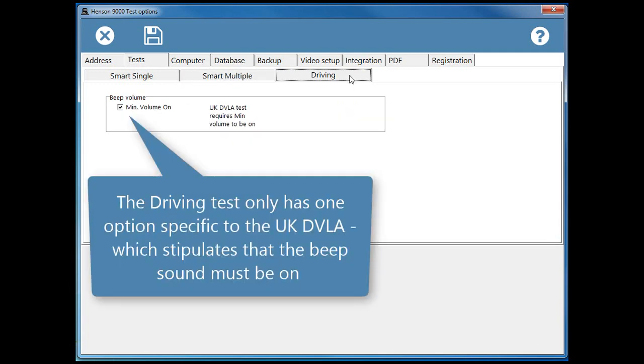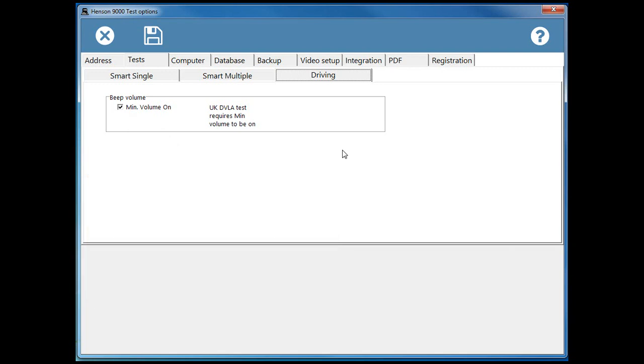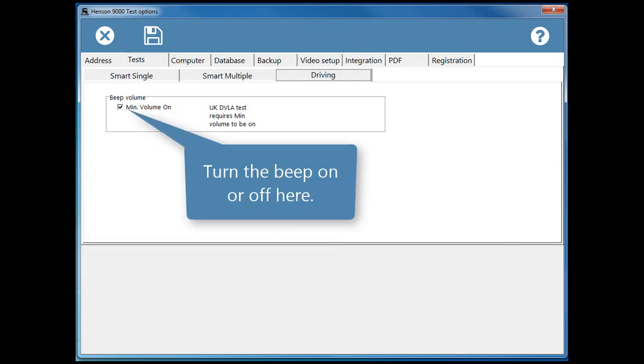The Driving Test only has one option specific to the UK DVLA which stipulates that the beep sound must be on. Turn the beep on or off here.